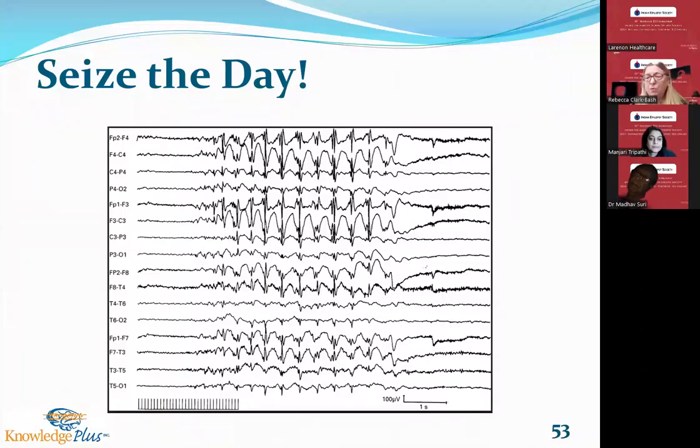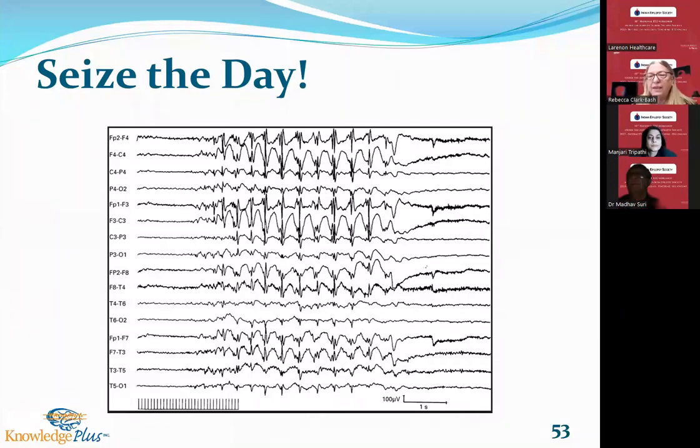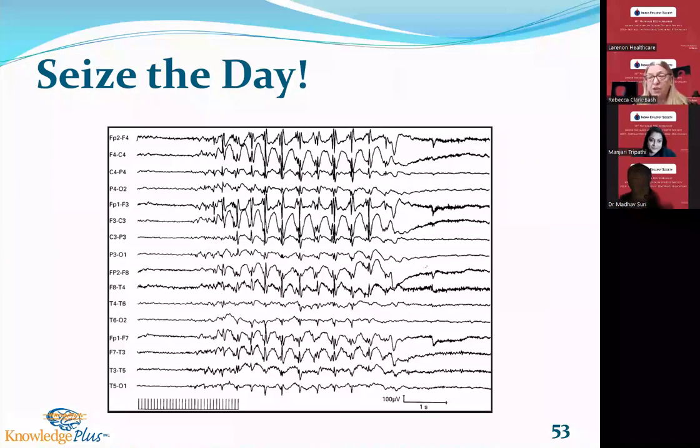And just from the work of Jasper and Hans Berger and Niedermeyer, they've all really identified that beta in and of itself doesn't lend itself to any, right? It's not useful. Could we count the beta in the frontals? We could, but it doesn't have any correlation. Same with temporal and theta. So you see more theta in the temporals, but it doesn't have any link unless it falls into the delta range, then that's significant and can have a correlate to epilepsy and seizure.